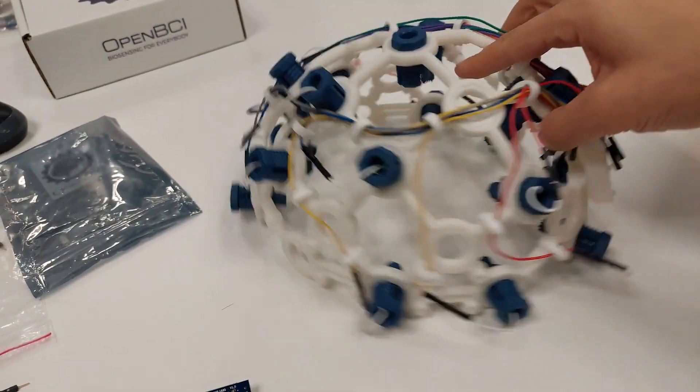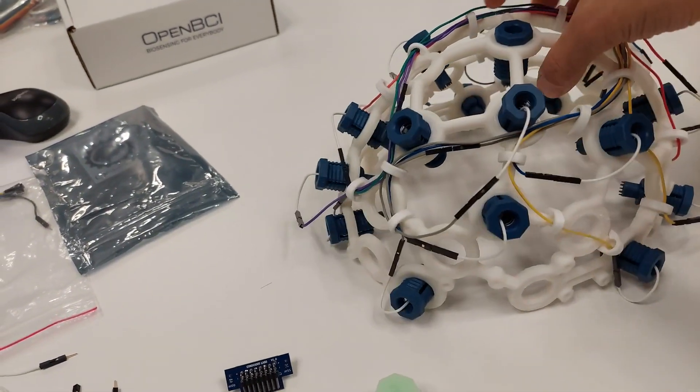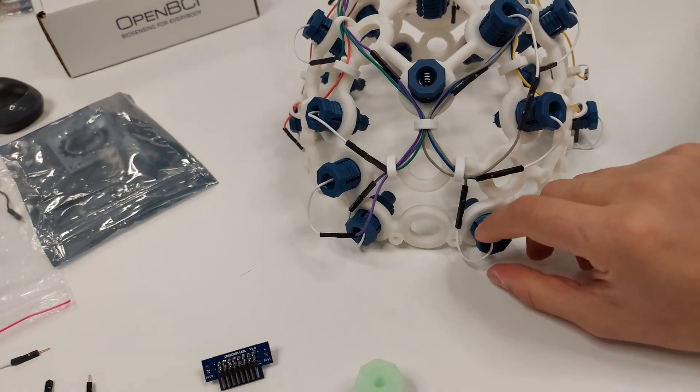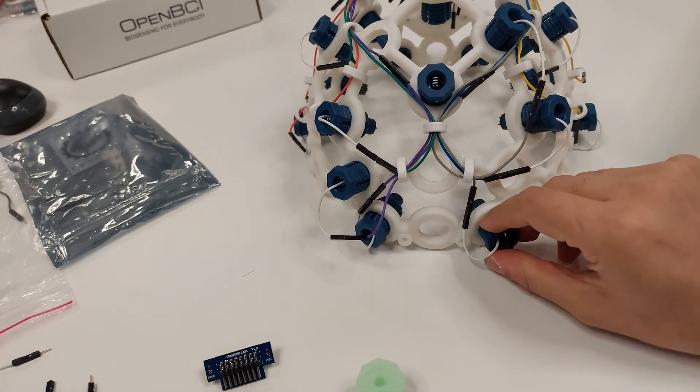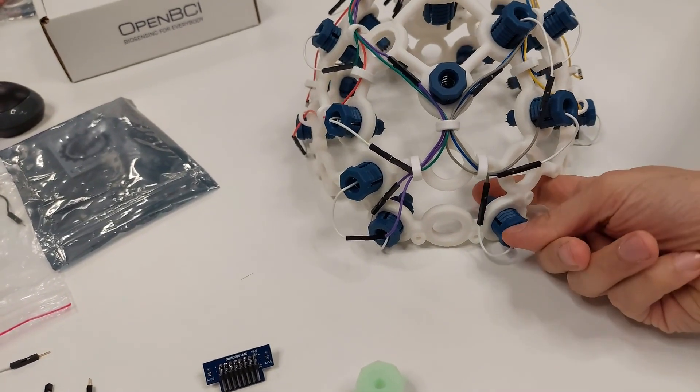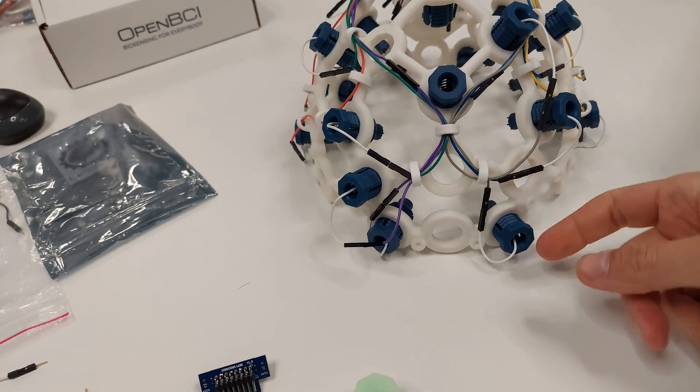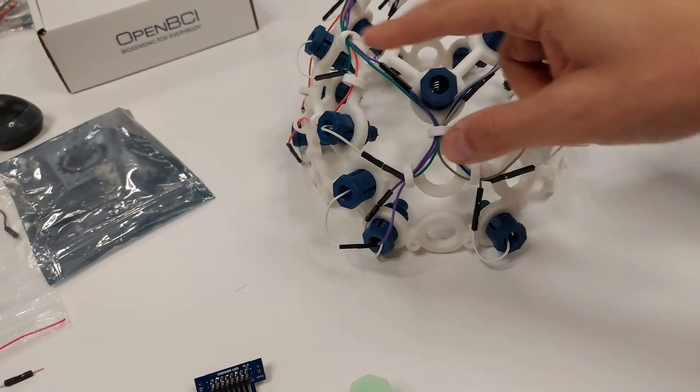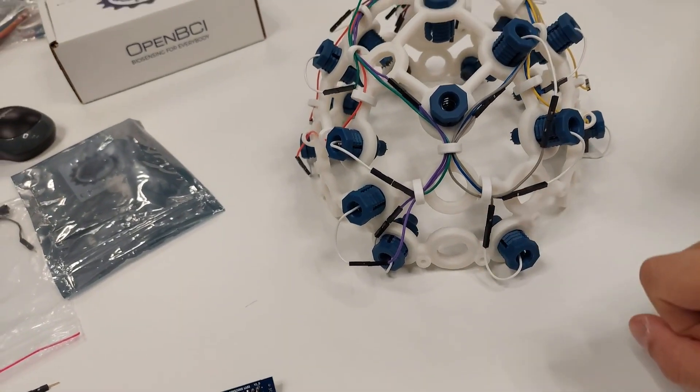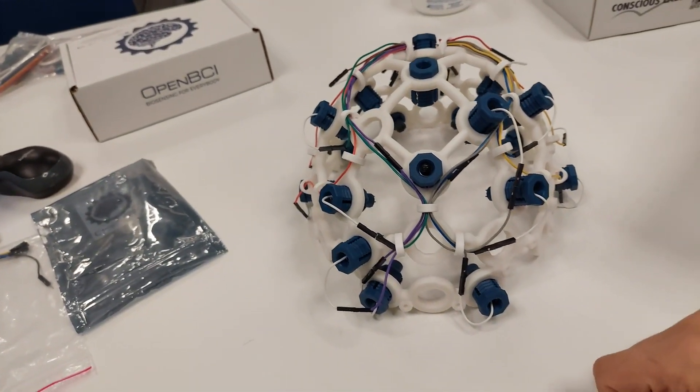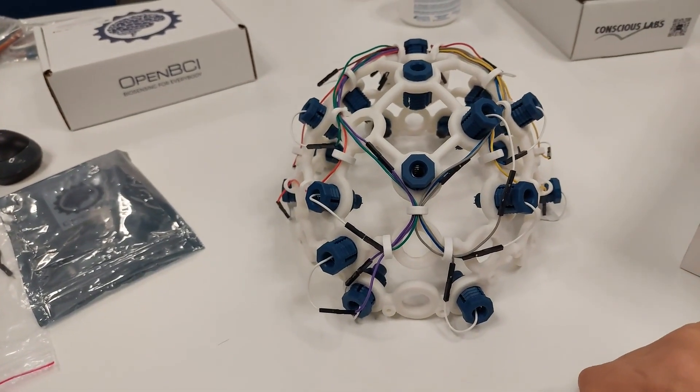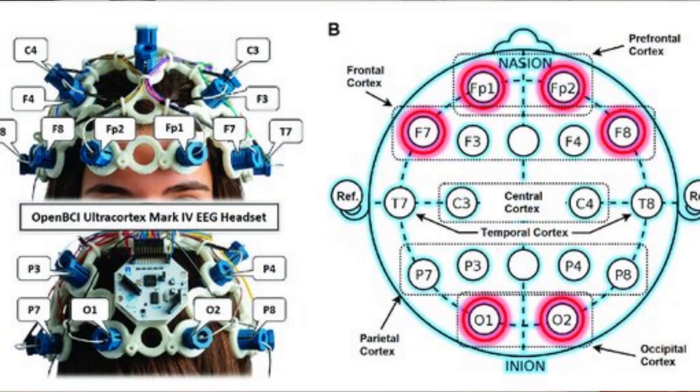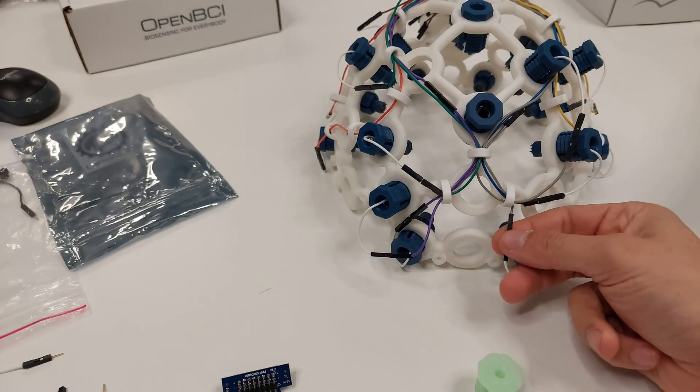So here I have already inserted the elements that allow you to put the electrodes within the mainframe and they substantially follow the 10-20 standard. They come with this kind of little connection thing.